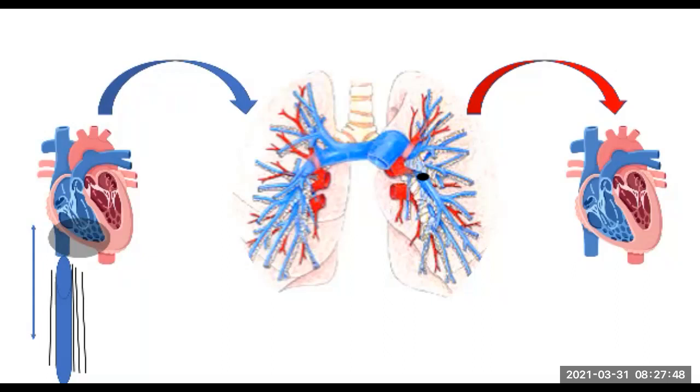And what we learned the last time was that every time you take a breath, your IVC is meant to collapse or at least go down slightly. But what do you think is going to happen now? Is it going to go down? No, it's not going to go down because basically there's too much pressure built up over there. So you can breathe in as hard as you want. You can't create negative pressure, so you can't suck anything through. So we've already covered quite a bit.